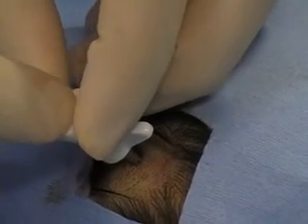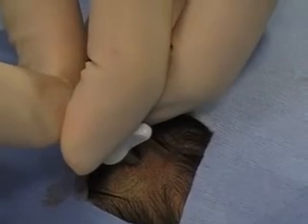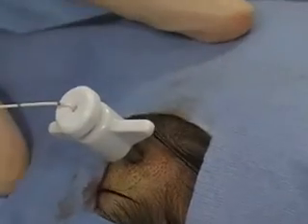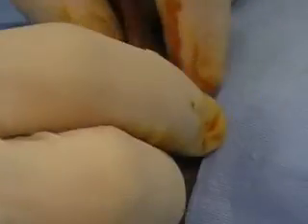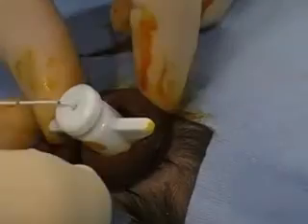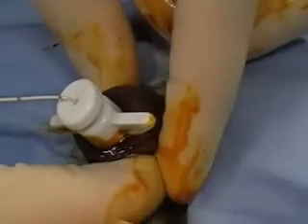When a strain gauge is used, a bend may be placed in the sensor at the desired depth, but other types of sensors should not be kinked. Dress the wound site using antiseptic soaked gauze. You may place a purse string suture, which can aid in wound closure after the bolt is removed.